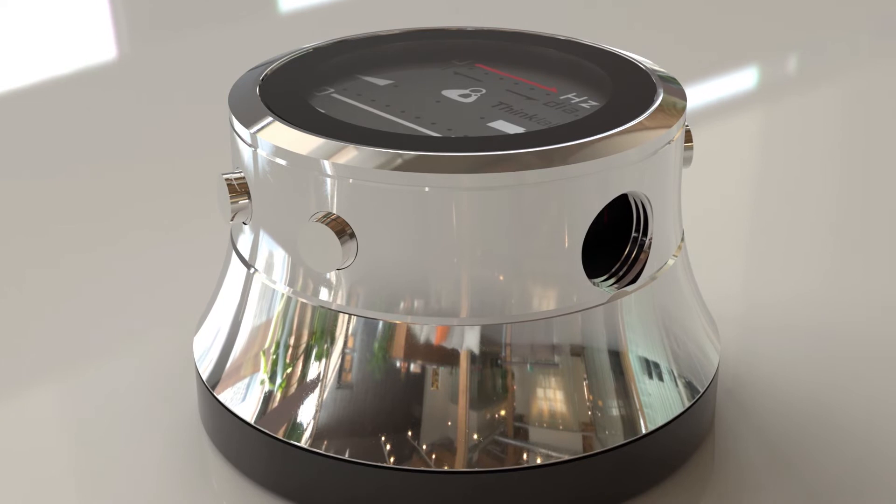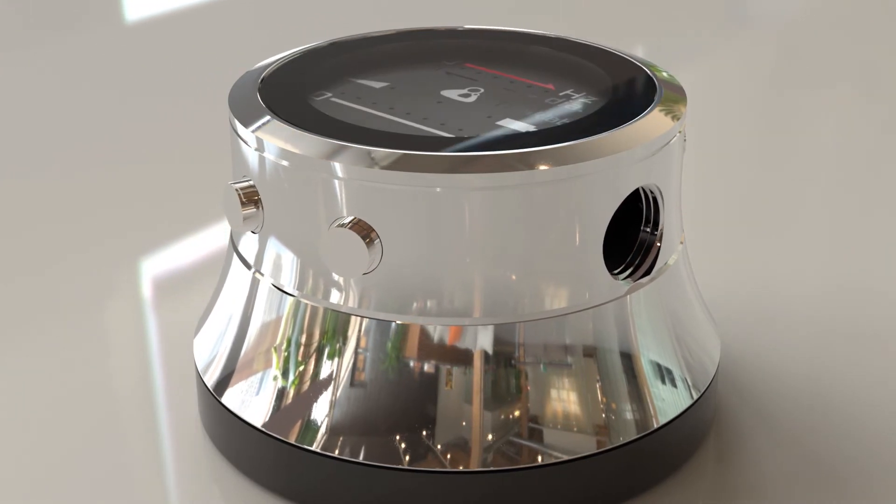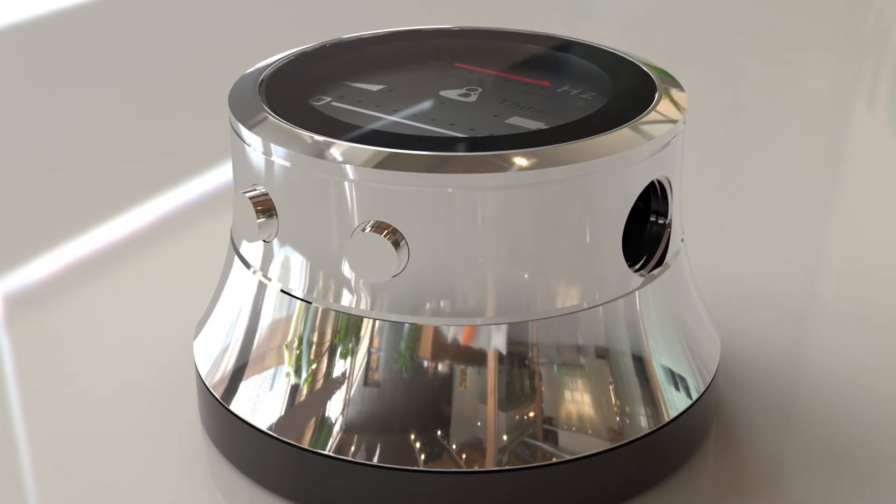You can change the automatic shutoff time on the Thinklabs One and set it between 1 and 10 minutes.